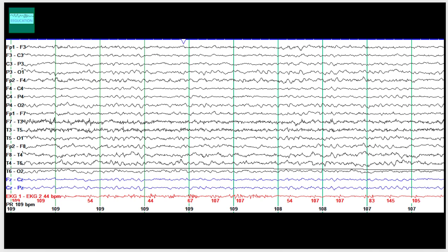Take a piece of paper, take a pen, and start writing your report. As a brief introduction: channels that end with an odd number are recording from the left side of the brain. Channels that end with an even number are recording from the right side of the brain. Channels that end with the letter Z are recording from the midline. The red channel is recording ECG or EKG, and the last channel shows the pulse rate from the pulse oximetry. Do you see any asymmetry between the left hemisphere and the right hemisphere?